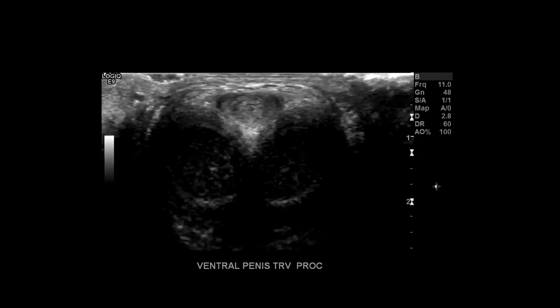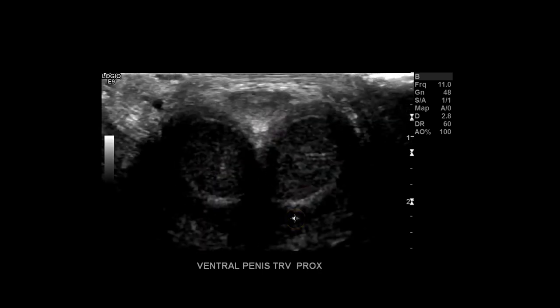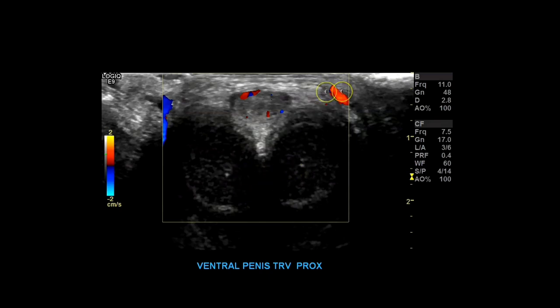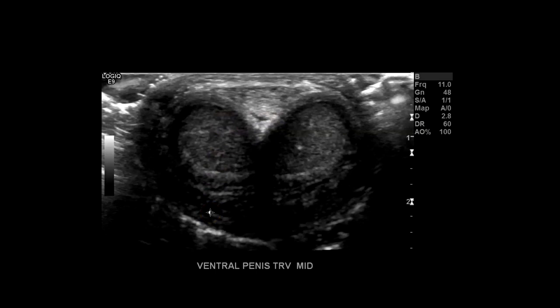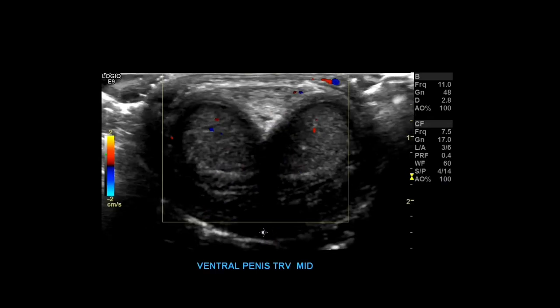Once done with that, position the penis toward the body and examine the corpus spongiosum from the ventral side. Label it ventral penis transverse proximal. Here's the corpus spongiosum, and in its center is where the urethra runs through. Now you have the corpus spongiosum proximally and the two corpus cavernosum posterior. Take a couple pictures — I labeled them CCC and CS. Here you can actually see the two cavernosal arteries; color doppler isn't really filling, but that's typical for a flaccid penis. Then move to mid ventral penis transverse mid — it tapers down toward the glans just like the corpus cavernosum.